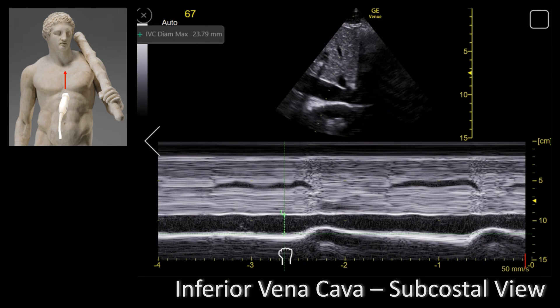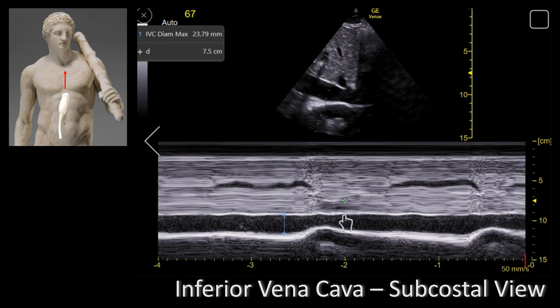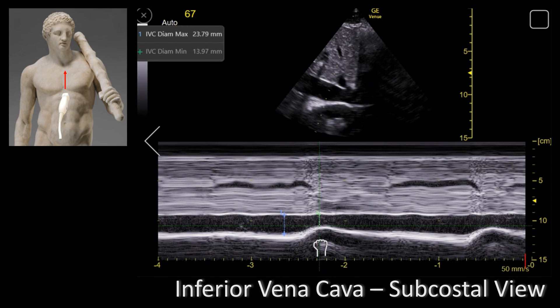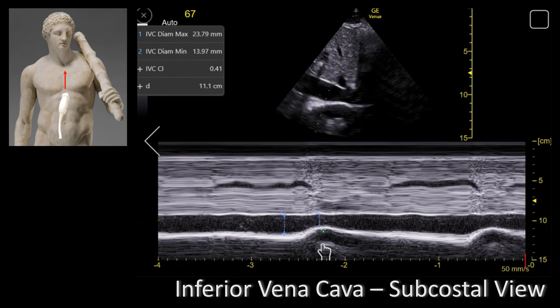There are two things we're focusing on: first, the diameter of the IVC, and then the collapsibility of it — expressed as a percentage. In this particular case the maximum diameter is 23 mm and the minimum diameter is 13.9 mm. The echo machine will show you the collapsibility; in this case it's 41 percent.